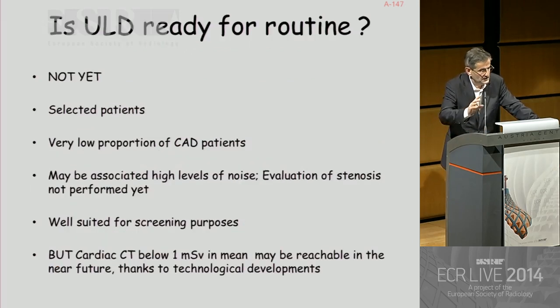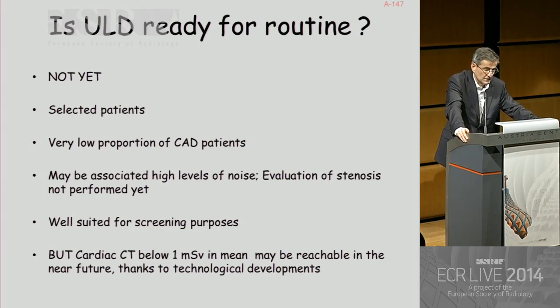So are these ultra-low dose protocols ready for routine? I think not yet, because the studies included selected patients with a very low proportion of diseased patients. In these studies there were some cases of very high levels of noise, and the evaluation of stenosis was not performed. But it may be well suited for screening purposes, and it introduced a new concept of low-dose scanning for screening.